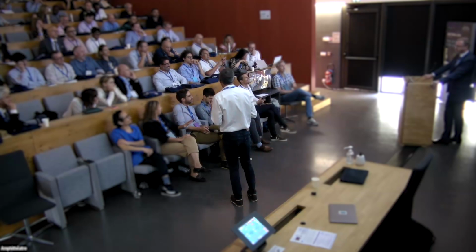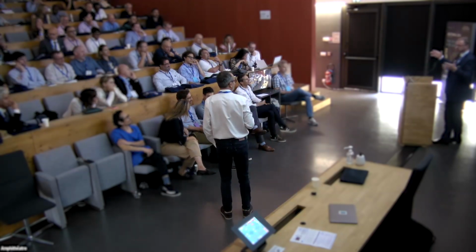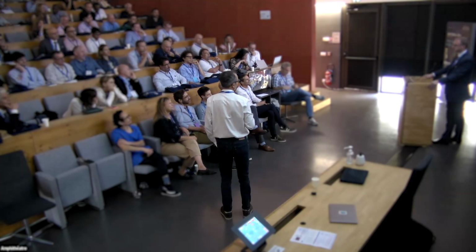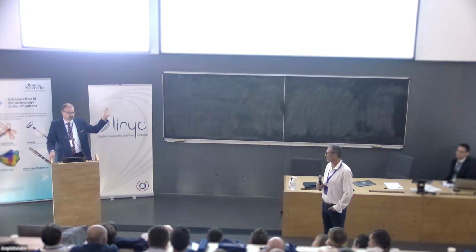And I should say too, on the symmetry of results with other PFA, I think the depth, broadly speaking, is probably going to be your maximum depth. You can't go to infinity with PFA, right? But this is also the reason why we have this catheter designed the way we did. I think you will see, and maybe have seen in some of the clinical results, there is a difference in performance. So having the catheter design in your wheelhouse to control is important.